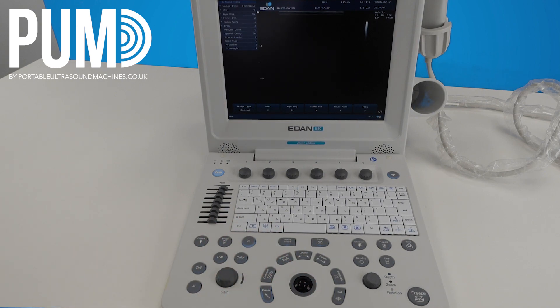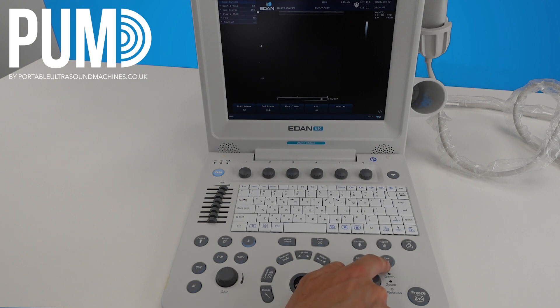In any of those modes, if you do want to save an image you can hit freeze, and then if you want use the trackball to scroll back to the right frame. You can then hit save image to save a still image, or save cine to save a cine loop. Once you've done that, just hit freeze again to start scanning.